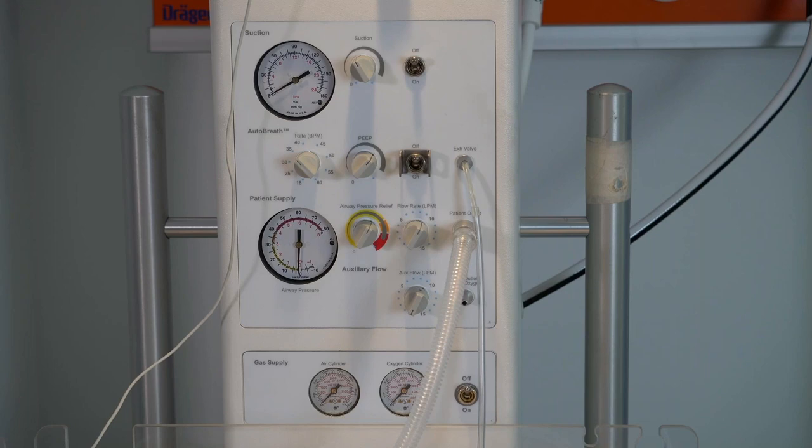Yes, I agree. And I think what's important to mention here is what we're trying to achieve during resuscitation. We're trying to achieve consistent spontaneous breathing. And if we provide too much support to the baby, if we set the respiratory rate at 60, that means there's going to be one breath every second. So there will be very few possibilities for the baby to actually initiate the breath on their own. So I have to agree with Linda that we can start with rather lower rates and see how the baby behaves. If the baby's respiratory drive is picking up and we see that the spontaneous breathing is picking up, then that's good. If we see that this is not enough, we can always increase the respiratory rate. But it's quite important to really try to allow the baby to start breathing spontaneously.